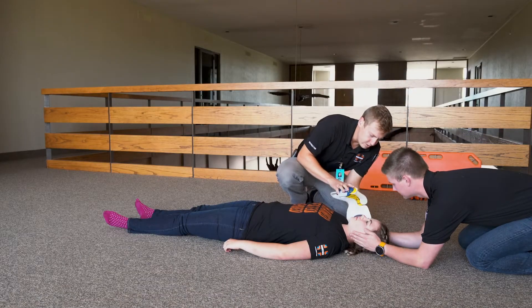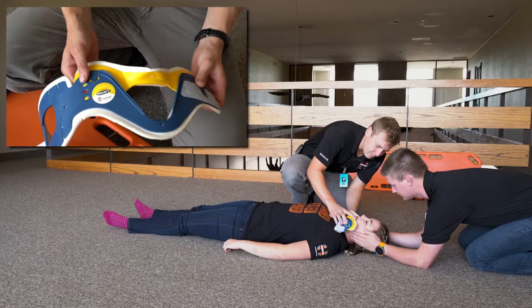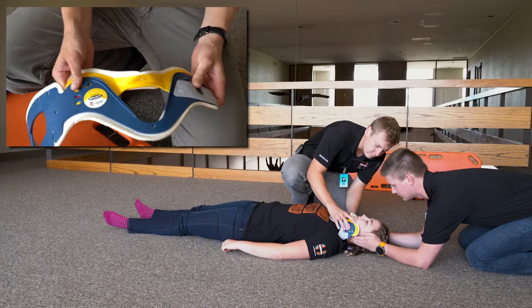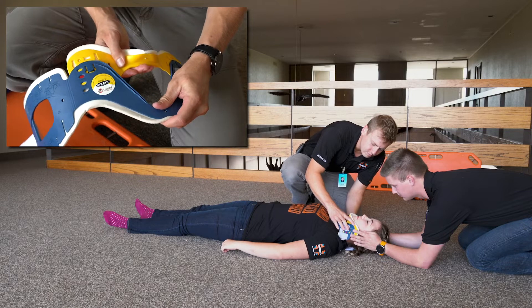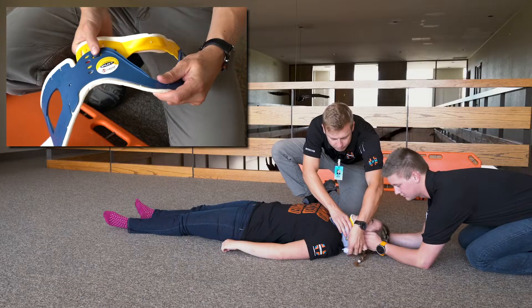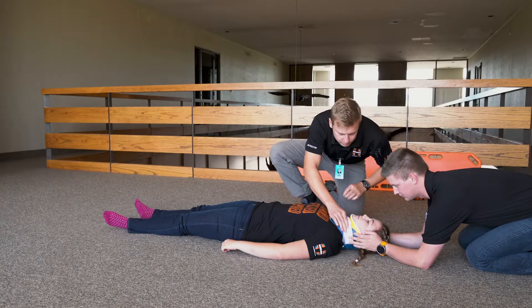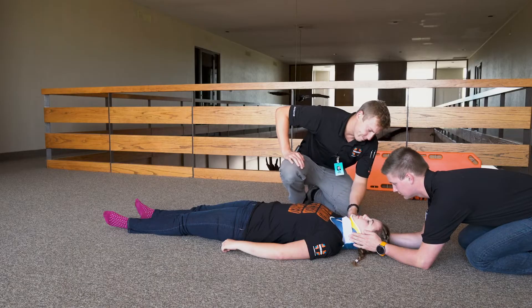Then apply an appropriately sized cervical collar. Different styles of C-collar exist — they'll all have a mechanism to unlock, adjust size as needed, and lock back in place.